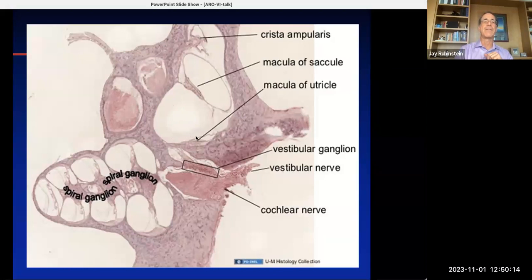Secondly, if you put an electrode in the vestibule, ostensibly to stimulate the saccule or the utricle, you're very, very close to the internal auditory canal. And it could be that the Las Palmas device is not actually stimulating the otoliths at all. It could just be providing generalized stimulation to the vestibular nerve, and providing tonic stimulation to the vestibular nerve may be what allows that device to restore stability partially in the patients who've received it.